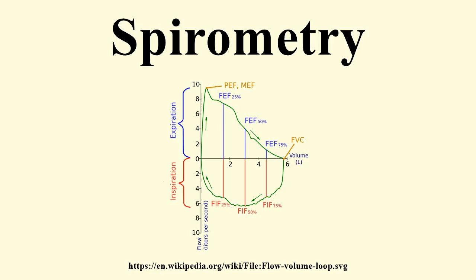Spirometry testing. Spirometer. The spirometry test is performed using a device called a spirometer, which comes in several different varieties. Most spirometers display the following graphs, called spirograms: a volume-time curve, showing volume along the y-axis and time along the x-axis. A flow-volume loop, which graphically depicts the rate of airflow on the y-axis and the total volume inspired or expired on the x-axis.